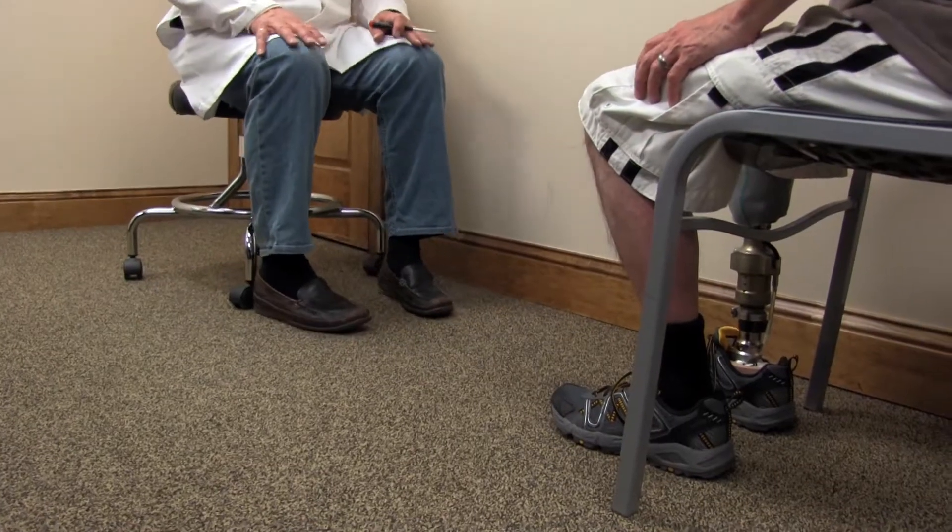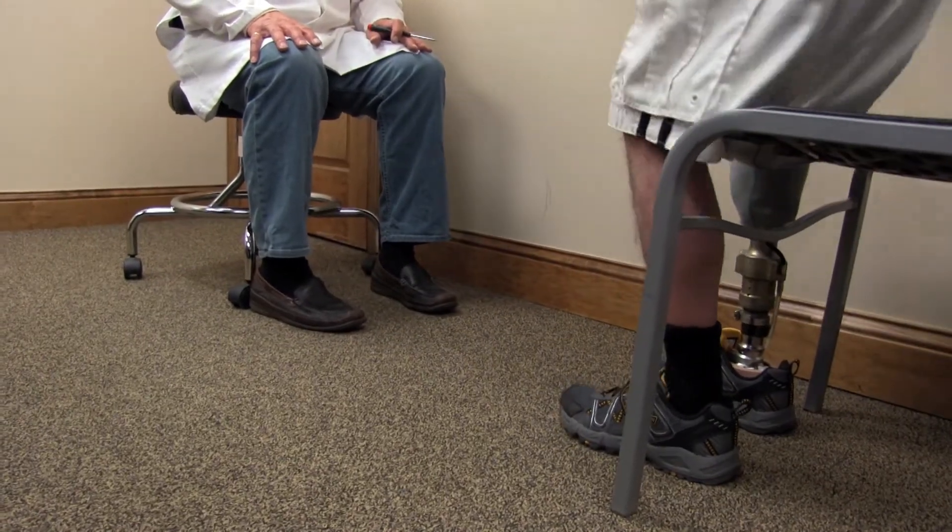Hydraulic feet also give the patient the ability to rest the foot flat on the floor when sitting, providing a comfortable, natural look.